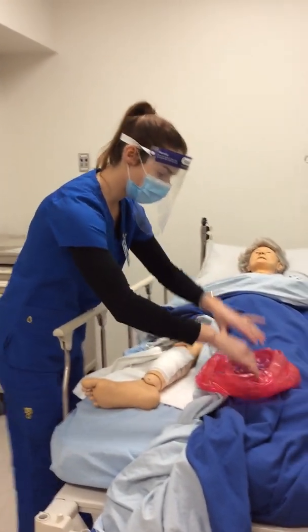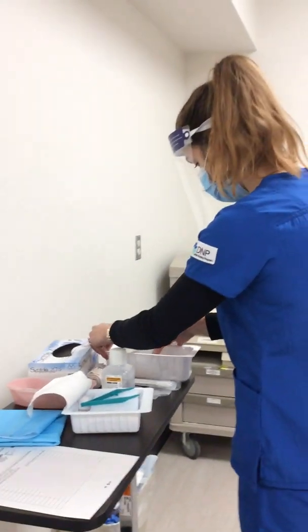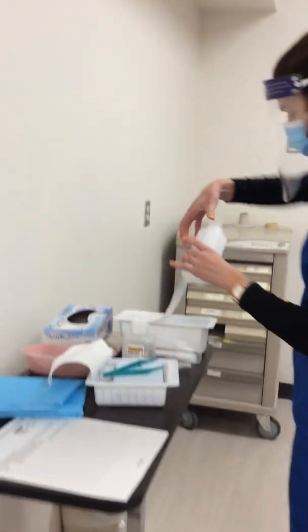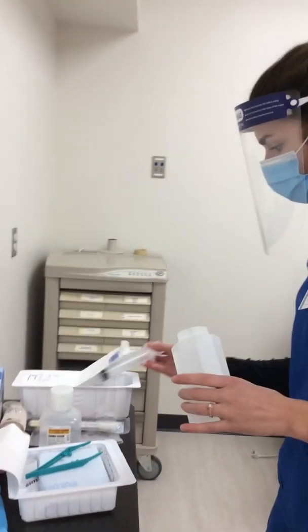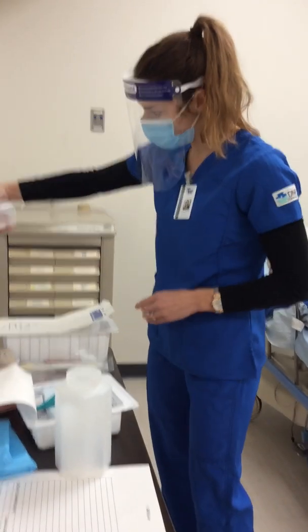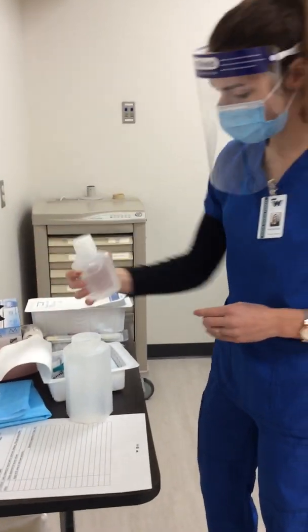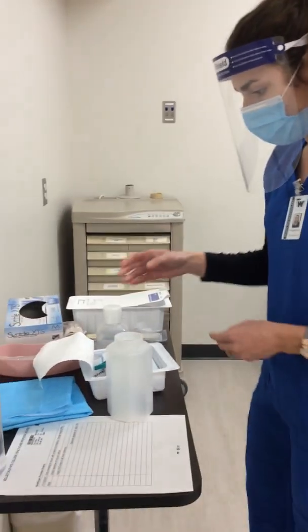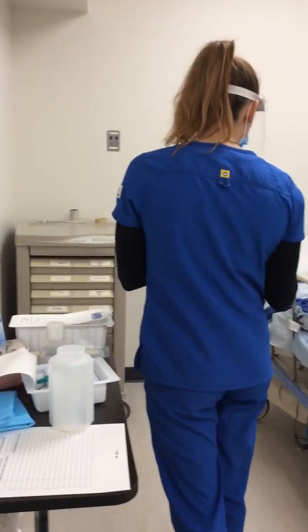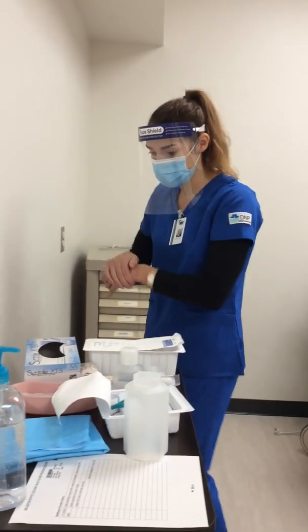Okay, then I'm going to prep my saline. So we're going to get our supplies out, place this back in there. We may or may not need it. Then we'll lift the saline and then pour it in here. Okay, now I'm going to wash my hands, put gloves on, and don PPE.